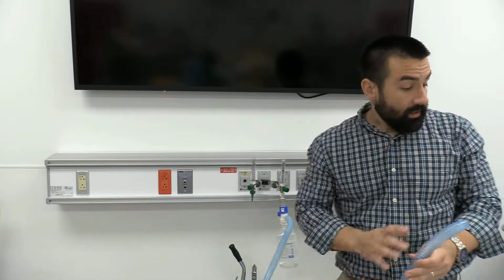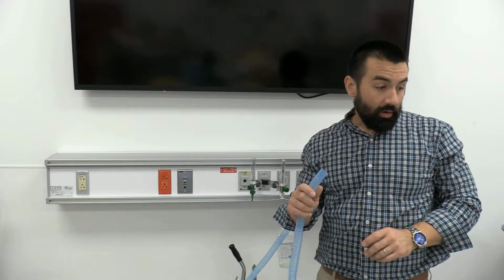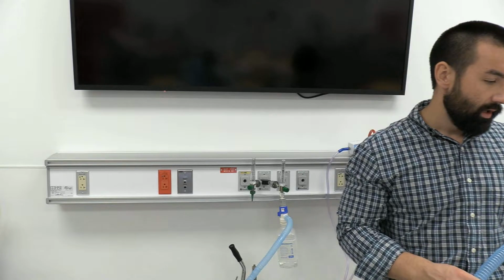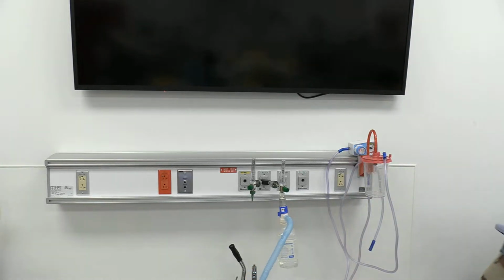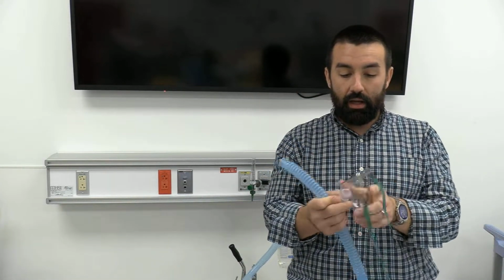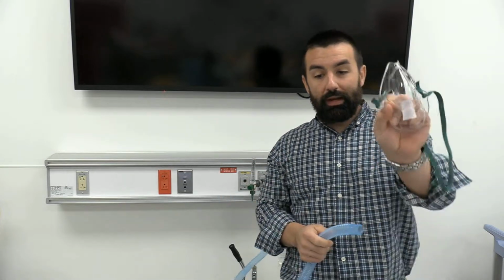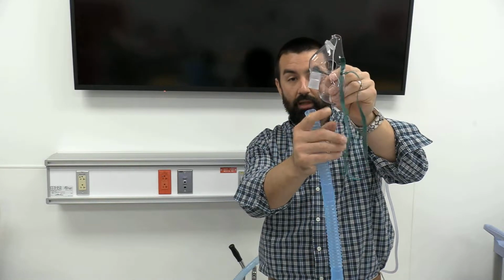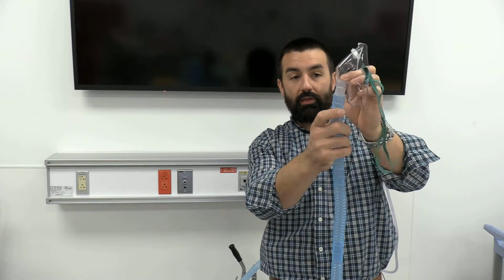Okay, so let's talk about appliances here. I'm going to show you the different things that we can attach to this, the most common ones at least, and then we'll talk about how to add on heat, in situations in which you would heat that and in which you would not. Now, one of the least common things, at least in my experience, that we hook this to, but you can, would be an aerosol face mask. You can see we've got the bigger holes here on the side, and the 22 millimeter outer diameter connector here at the outlet, and we can hook something like that straight on.